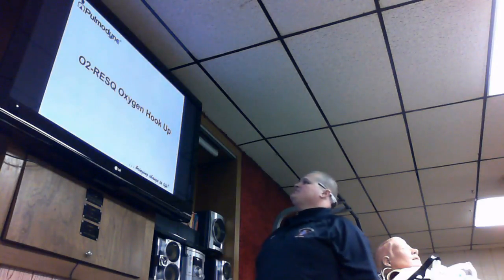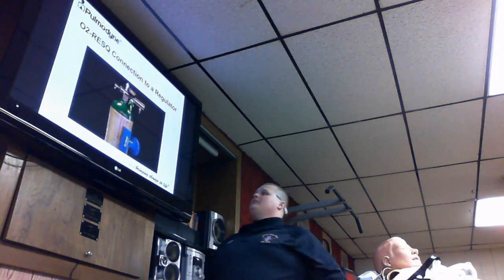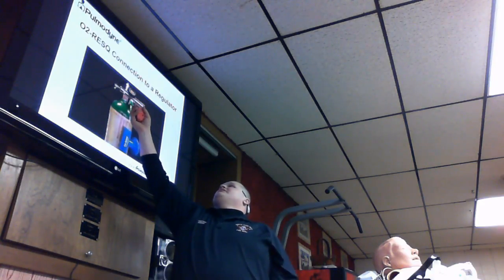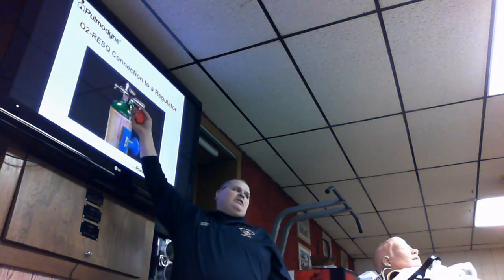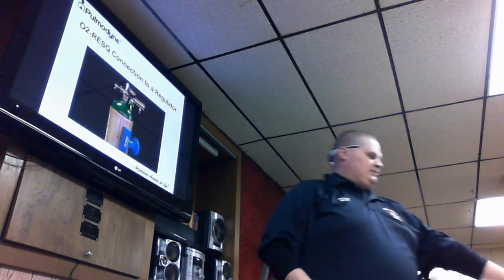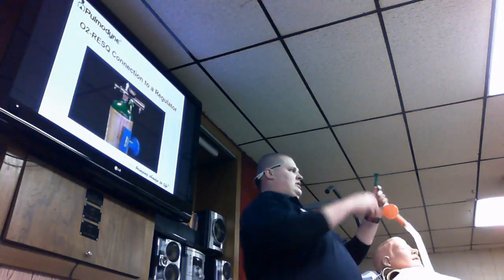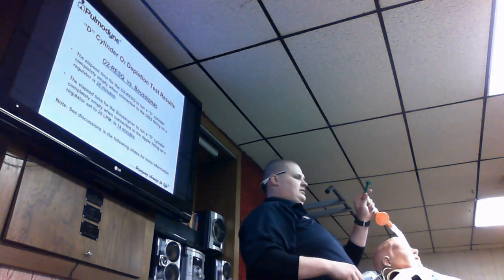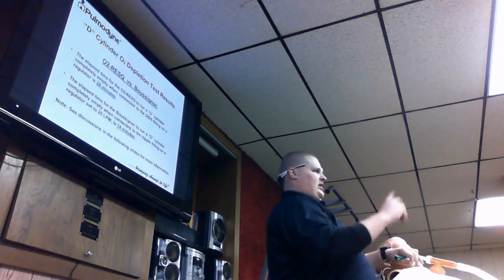But so what we'll do is just kind of talk about the hookup. We have the same connection, Christmas tree. Your O2 bottle's got to have this special adapter on it so it connects up. Ours is real good. All you got to do is make sure your bottle's on. Connect your Christmas tree like such, like we have here. You connect this to your Christmas tree on the end, and then go ahead and screw it on, okay? And then what it does is it automatically turns on.